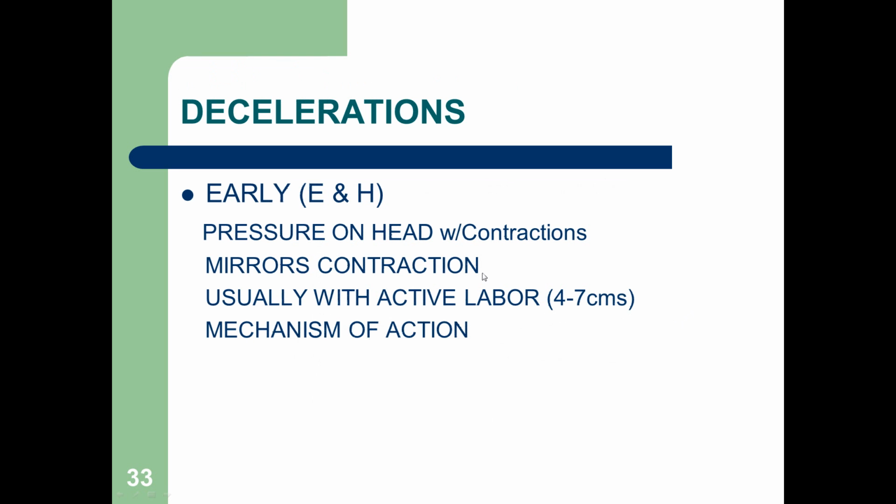Decels. Early decels are typically U-shaped and mirror a contraction, usually benign, and reflect the compression of the fetal head as it enters the birth canal. Okay, so early is usually due to head compression.